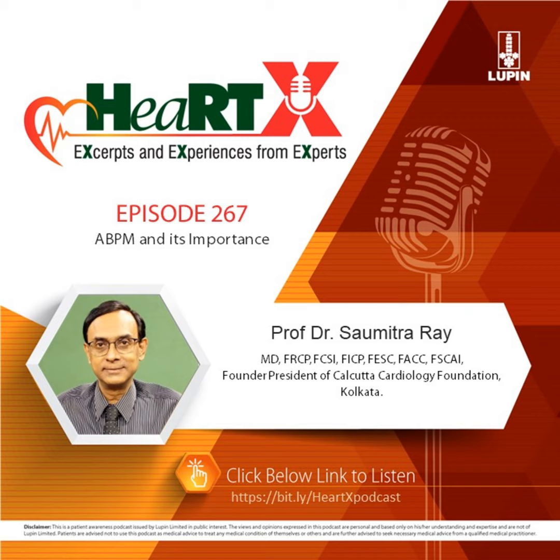Today, I'll talk about ambulatory blood pressure monitoring and its importance. Ambulatory blood pressure monitoring, or ABPM, provides a 24-hour account of the patient's state and is useful for diagnosing primary and secondary hypertension and differentiating it from the white coat and masked subtypes. It is accurate in predicting the risk of cardiovascular disease and mortality.